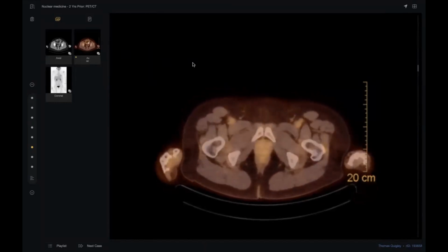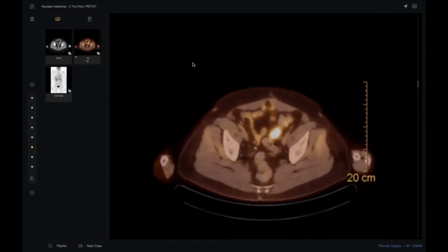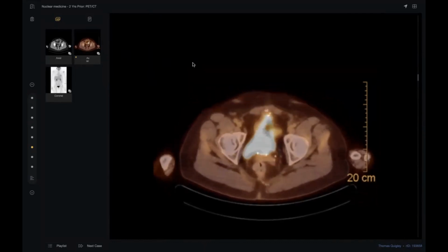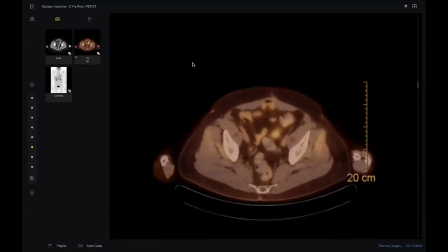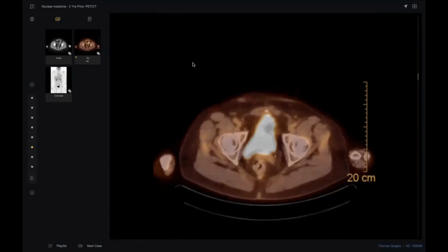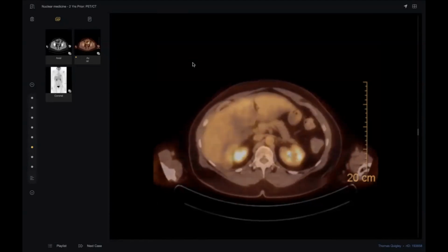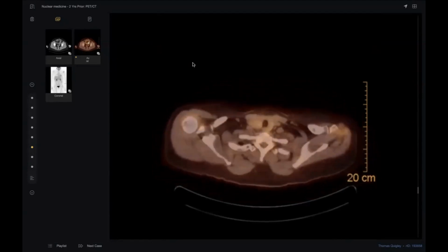What happened? Tell me. Okay. So there is an abnormal avid lesion in the sigmoid colon. Highly likely, yes. Avid FDG uptake or increased SUV, standard uptake value. In the sigmoid colon, most likely to be the primary lesion. I would like to advise for colonoscopy, biopsy, histopathology, and to refer for MDT meeting discussion and follow-up. Thank you, doctor, so much.